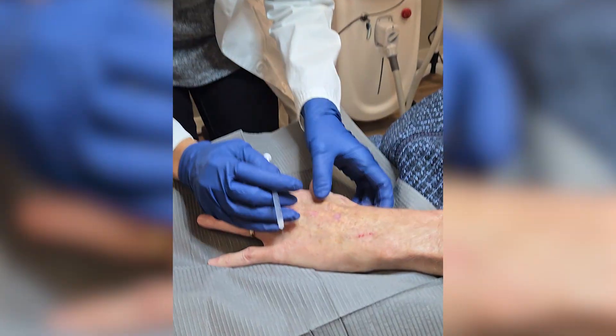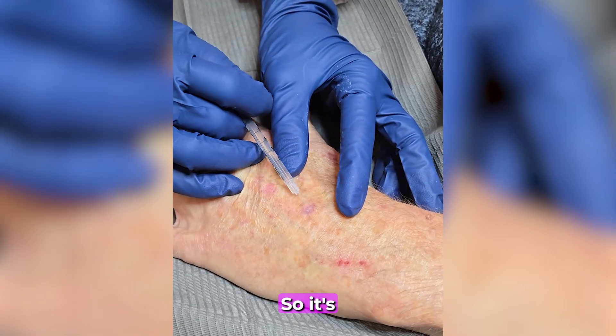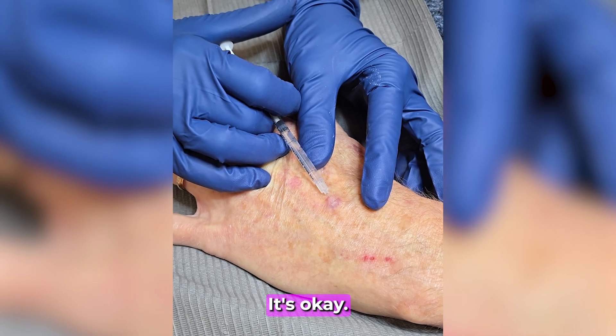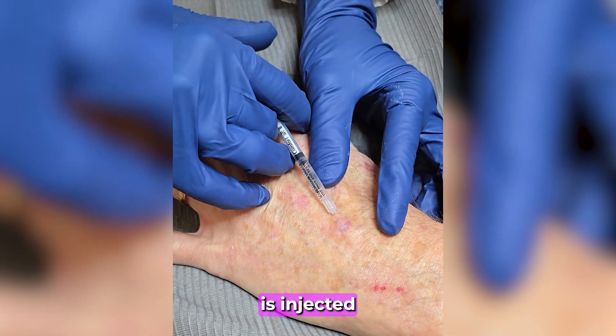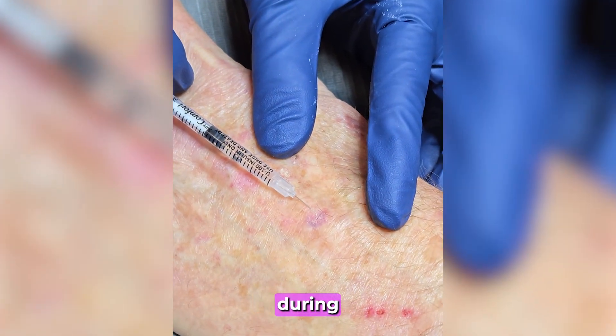So here comes the poke — sorry, it's going to burn and sting a little bit. A small amount of local anesthetic is injected to numb the area, so the patient feels minimal to no pain during the procedure.